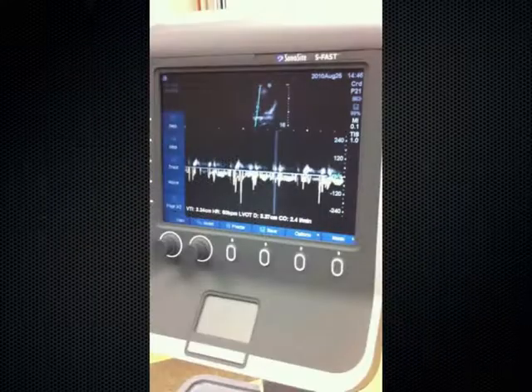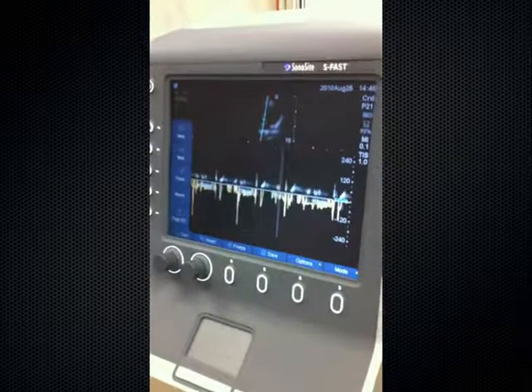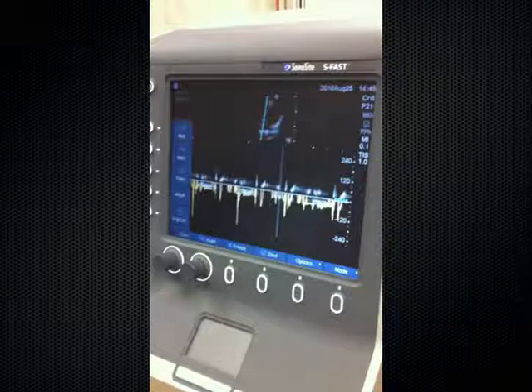Yes. So you have parabolic flow coming out. When you do the gating, how large can you take the gate? Because depending where you are, you're going to have completely skewed results. Yeah, there's a sampling gate that you can make wider or skinnier. That's a good question, and I've been messing with that sampling gate. What he's asking about, that little TIE fighter, you can spread its wings further apart or more narrow, and that changes your waveform quite a bit. So that's something we've got to mess around with. This is all brand new stuff, so I don't know the exact answer to your question.